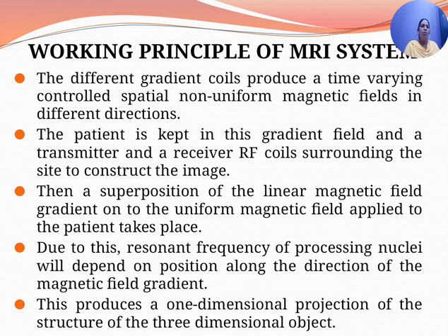As I told you, the RF coils work as both transmitter and receiver. These coils are located within the magnet assembly relatively close to the patient. They function as antennas for both transmitting signals to the body and receiving signals from the tissues. We have different designs based upon the different anatomical regions: the body, the head, and the surface coils.